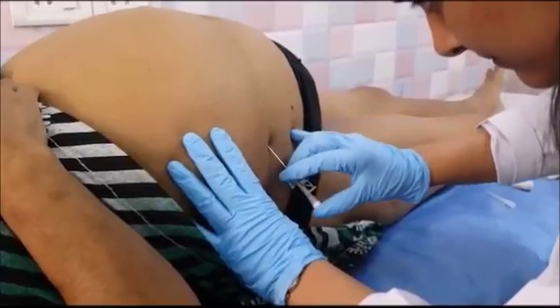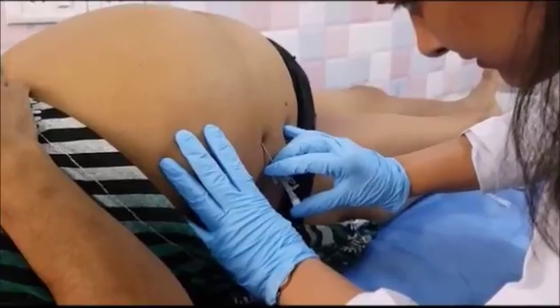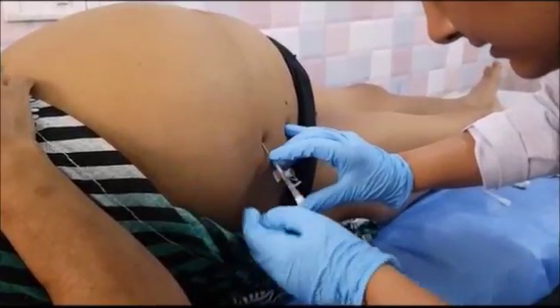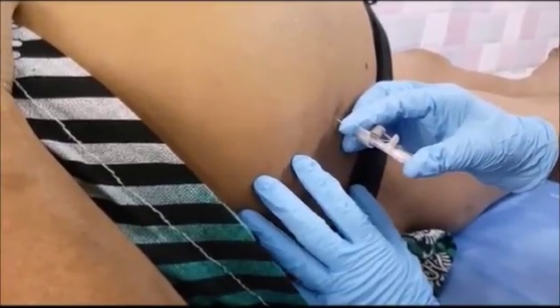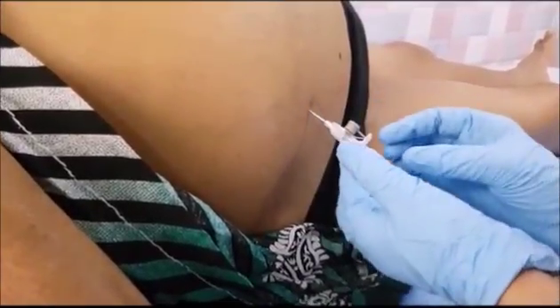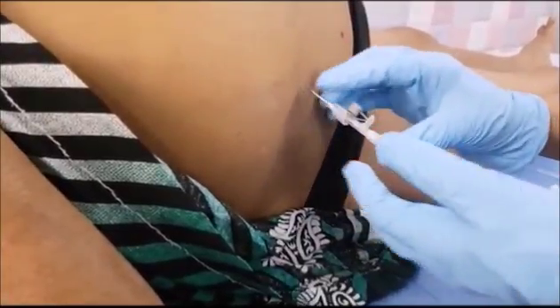We will go first parallel to the wall in the subcutaneous tissue area and skin, then we will go perpendicular to the wall, and in the end we will go again parallel to the wall when we reach the abdomen.